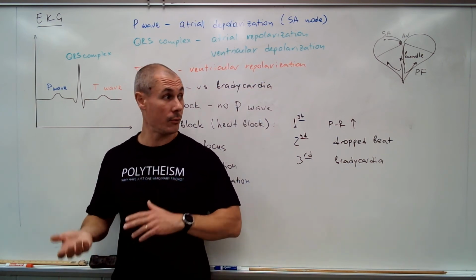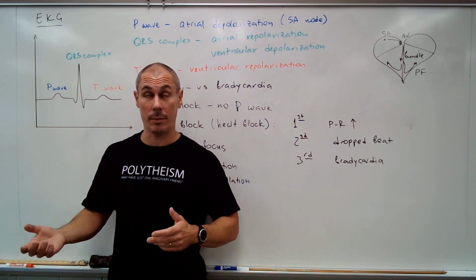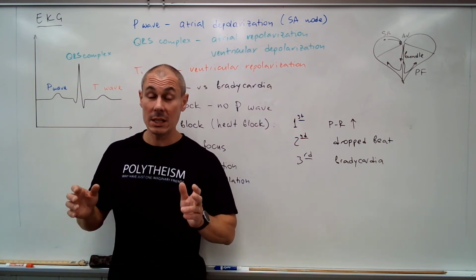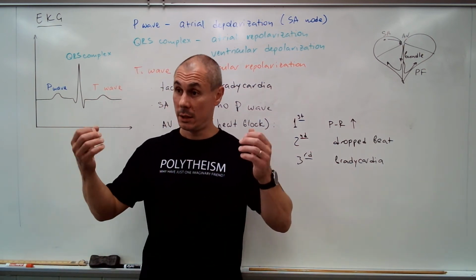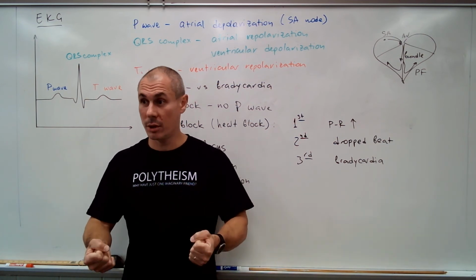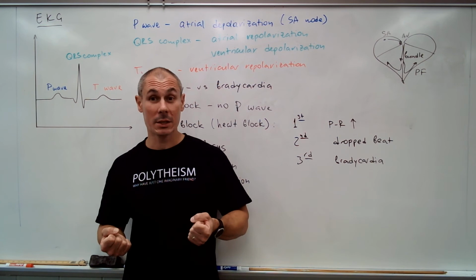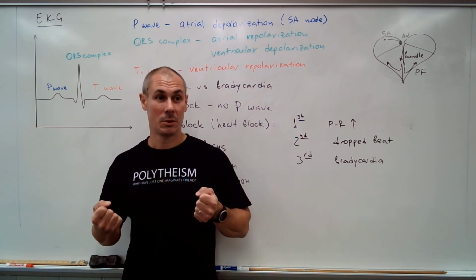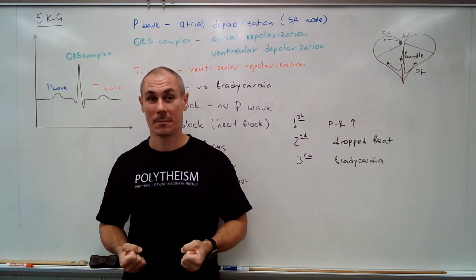Now if you have an AED, I can never remember. D stands for defibrillator, that's what I remember. AE, I don't remember what it stands for. This electrical thing with two pads. When you electrocute a person with ventricular fibrillation, there are a couple of misconceptions. So what do you think happens when you electrocute the person?